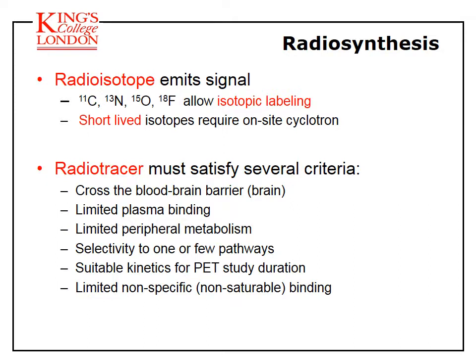So one could go to the pub, get drunk, pop a pill, start the car and drive normally, only to crash an hour later as the drug was cleared very quickly out of the brain. So it wasn't really a good drug, but it is an excellent PET tracer to measure GABA function, as in 1 hour or 1 hour and a half the tracer can go in and track the whole path and then exit.